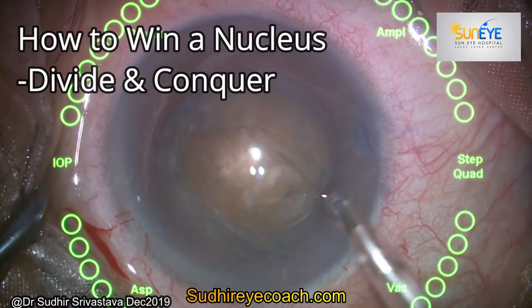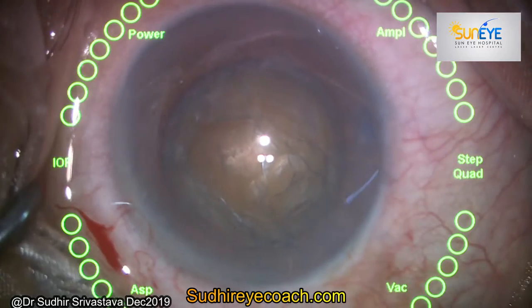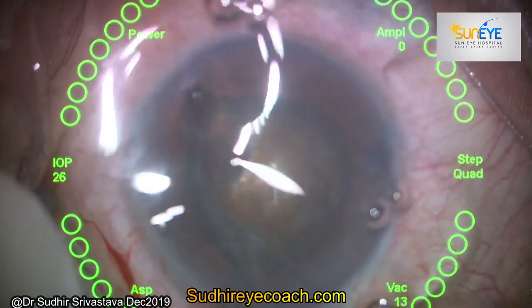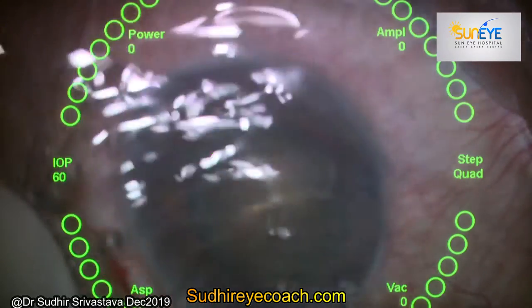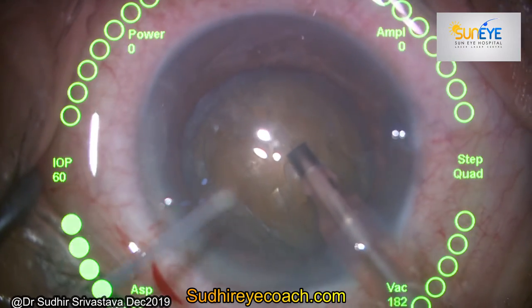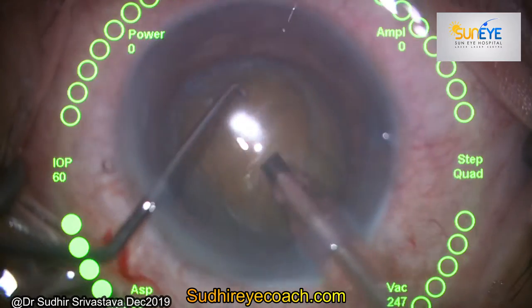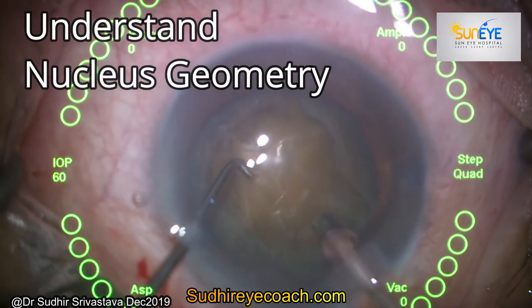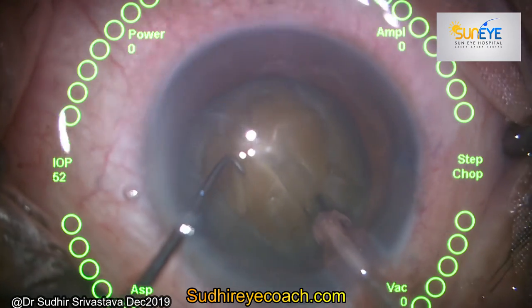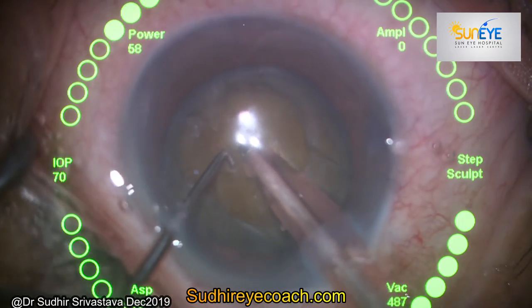Hello everyone, today I'll be sharing a video regarding the divide and conquer technique of phaco fragmentation. I learned this technique when I started my training, however I don't do it on a regular basis now. If you are new in phaco or planning to start learning phaco, you have to learn about the nucleus geometry — its size, thickness, texture, and behavior. Divide and conquer offers a great way to learn about nucleus behavior and geometry.